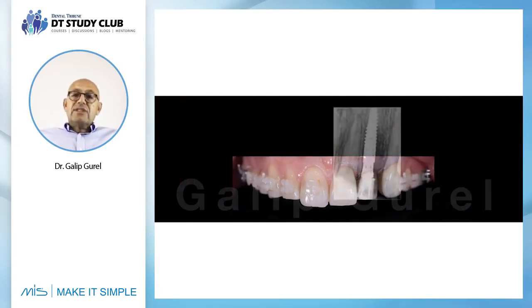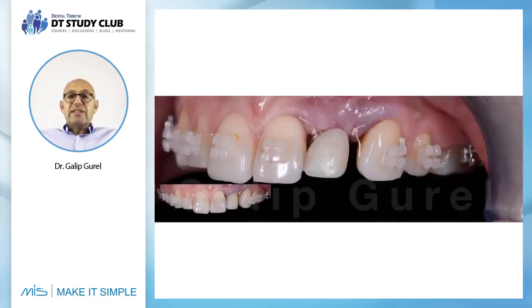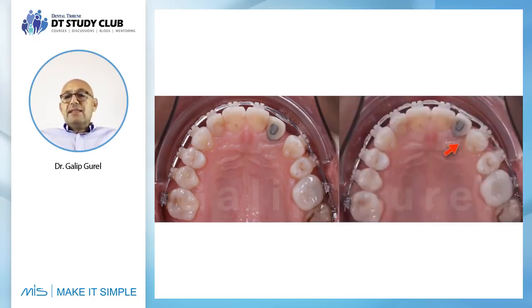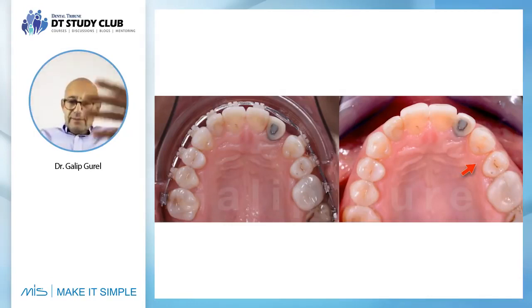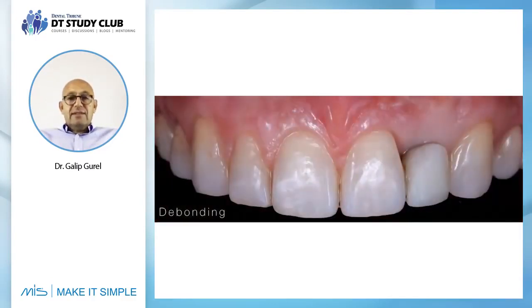Now I send the patient back to Nuno, and what Nuno has to do is orthodontically start closing this gap. So first he moves the canine towards the lateral, and then moves the premolar towards the canine. So without opening an extra step there, by moving the posterior teeth mesially, he closes this gap, and this is the final result. And see, when he takes the braces out, beautiful, beautiful outcome.